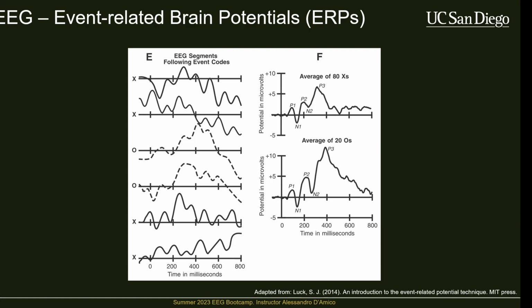Things like that. That's when it starts becoming its own fully fledged component versus just some peaks and troughs on a wave. But there's nuance behind it, so it's fair to be confused. Honestly, a lot of ERP researchers would struggle to give a very clean definition for what a component is, because it's an amalgamation of a lot of things.